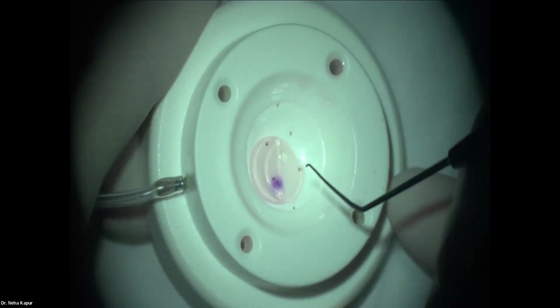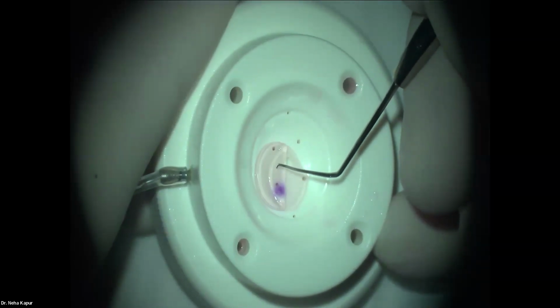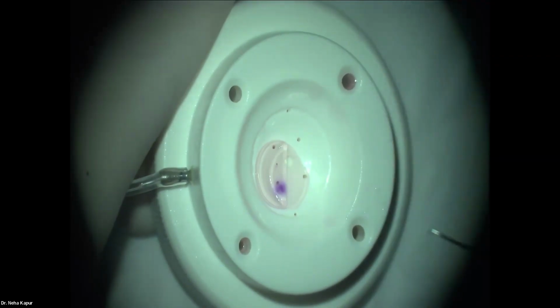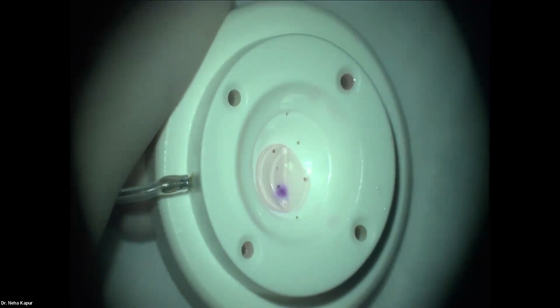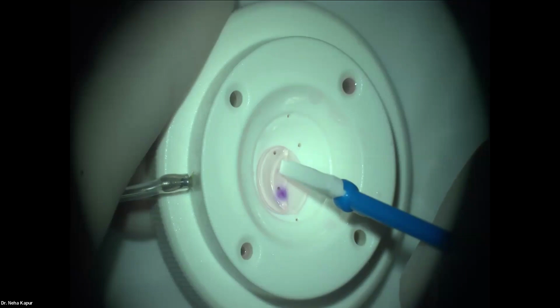It's good to not take the ink pen directly on the eye. Instead, what we prefer to do is that we take a dialer, and with the limb of the dialer, you put it in ink. And there still is some fluid there because the mark is not taking up. So dry it before.